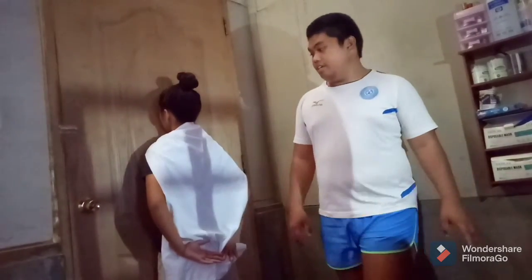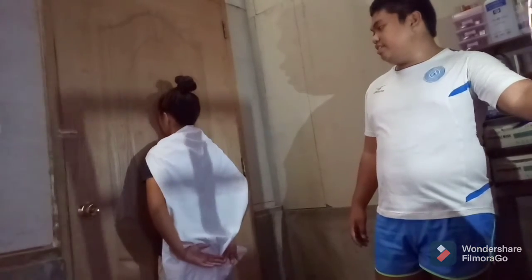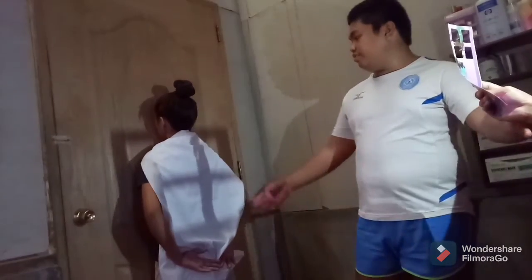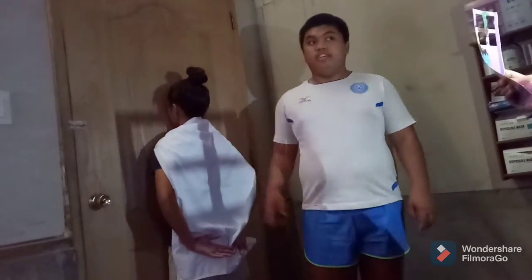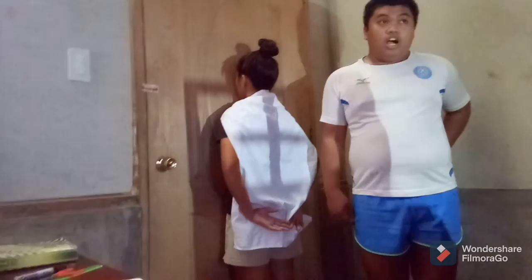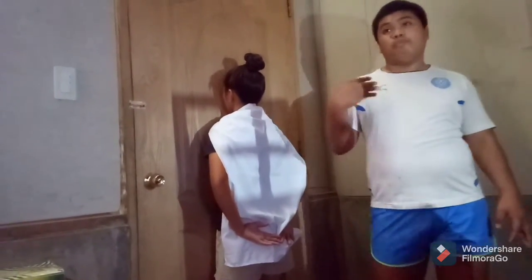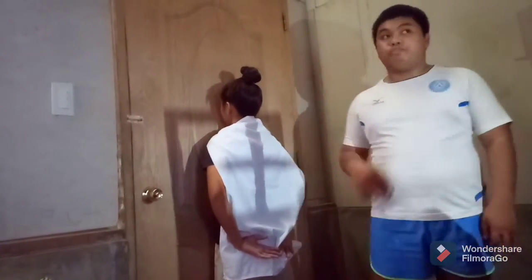So, the central ray must be perpendicular to the inferior angle of the scapula. So that would be where the central ray must be placed. Then again, before exposing the patient, instruct the patient to hold his breath upon the exposure.